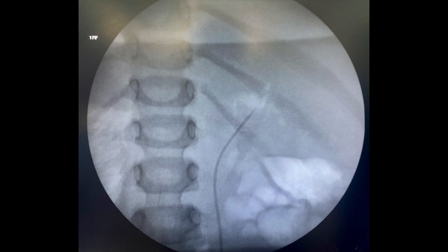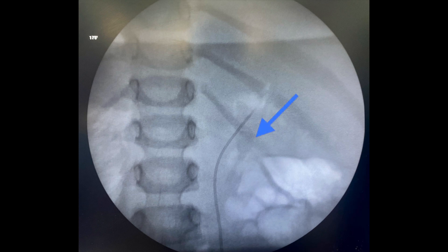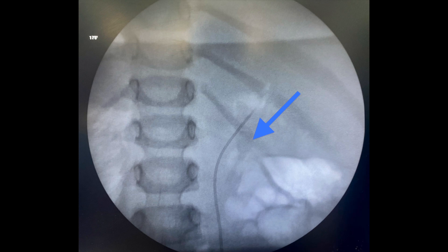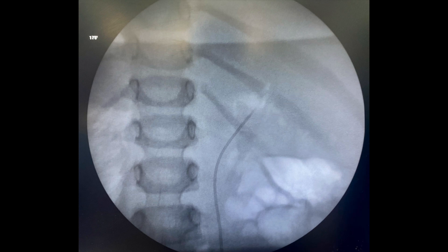This is the intraoperative fluoroscopy image. After placing a 4-French ureteric catheter, you can see a small radiodense shadow in the region of the right kidney, just lateral to the ureteric catheter.